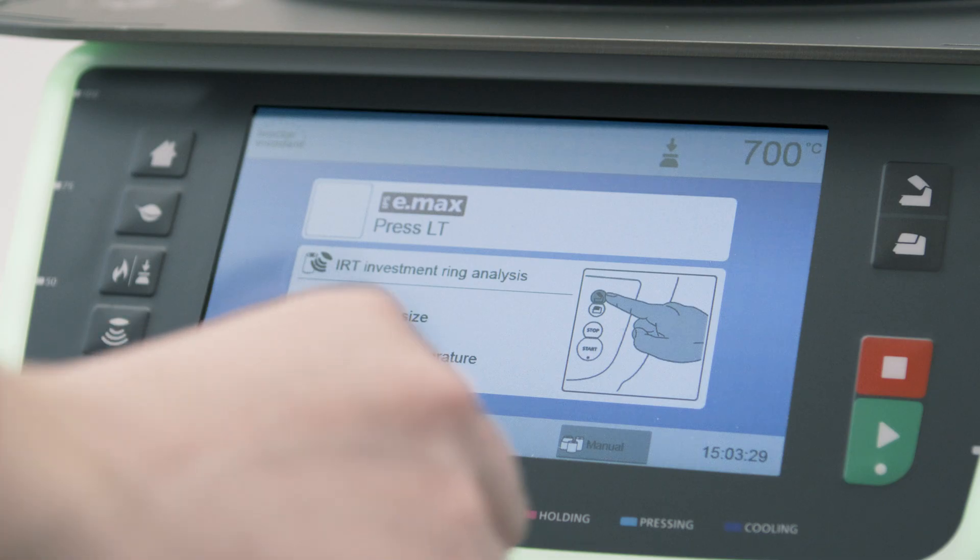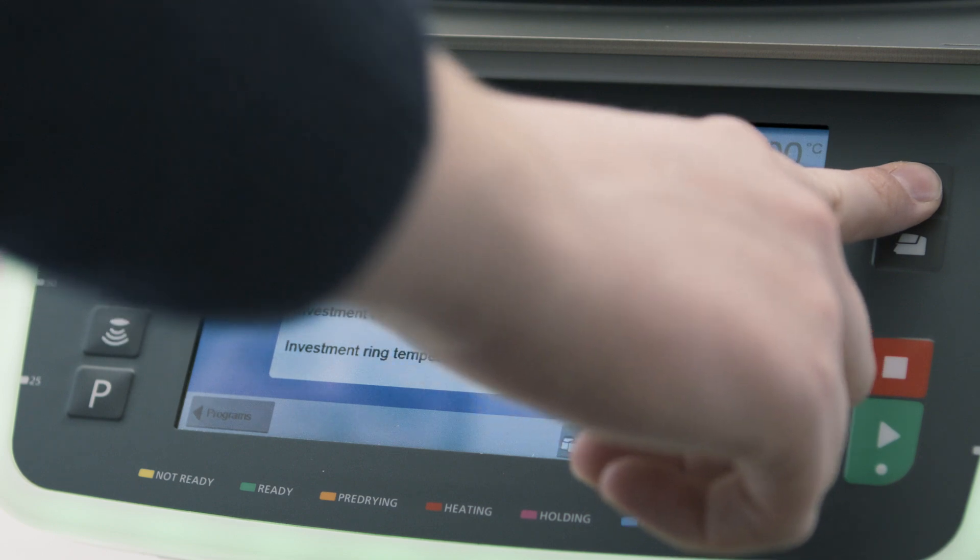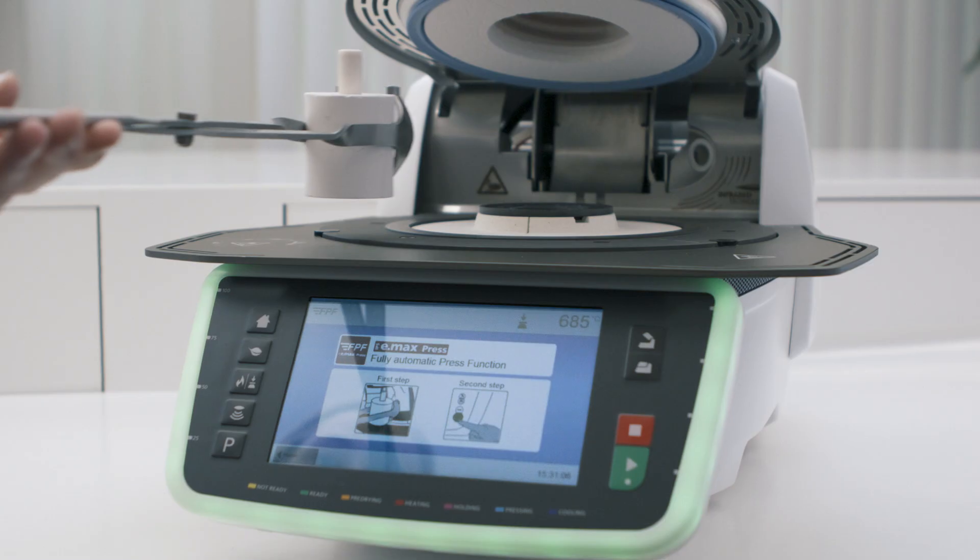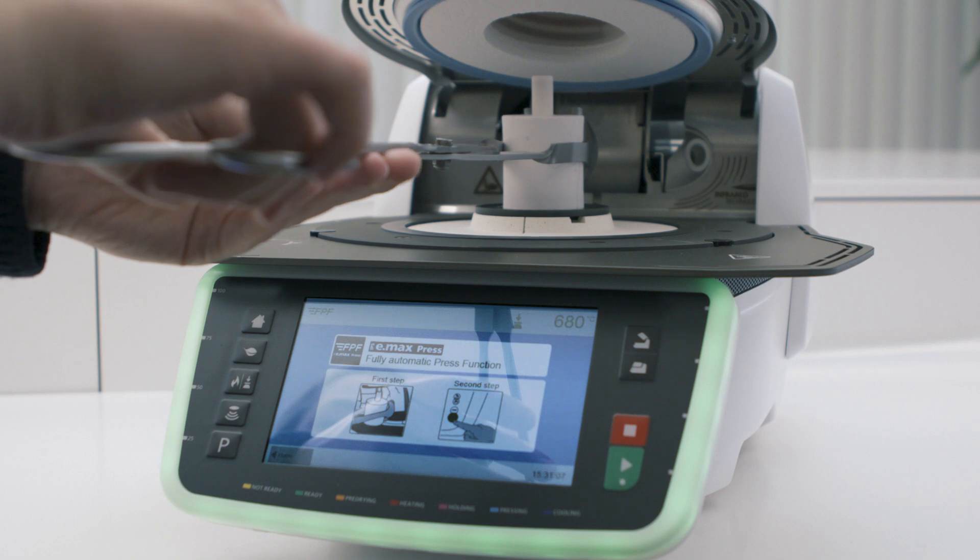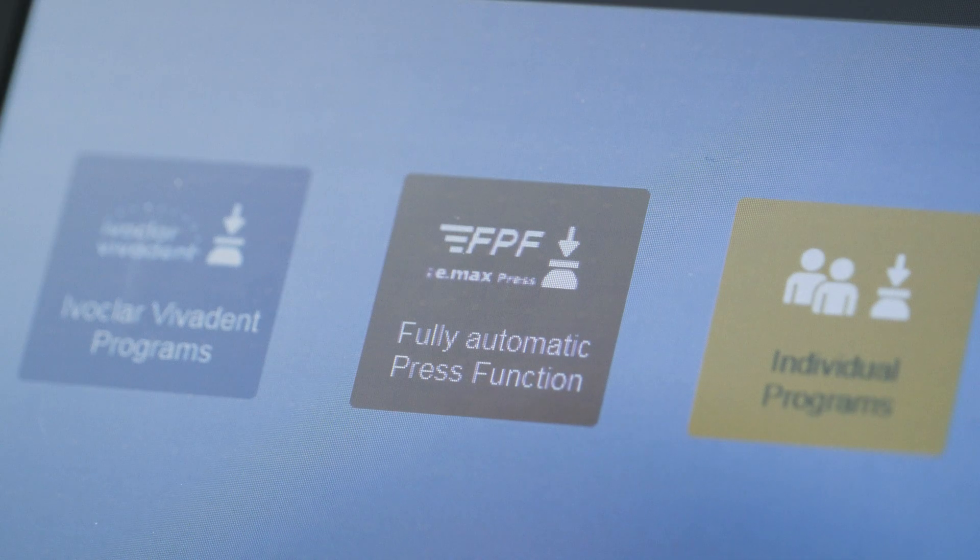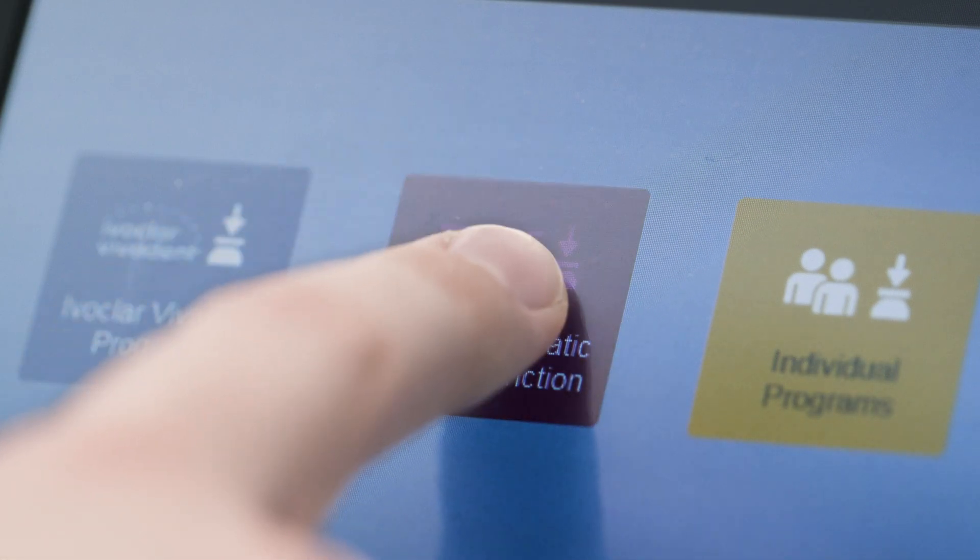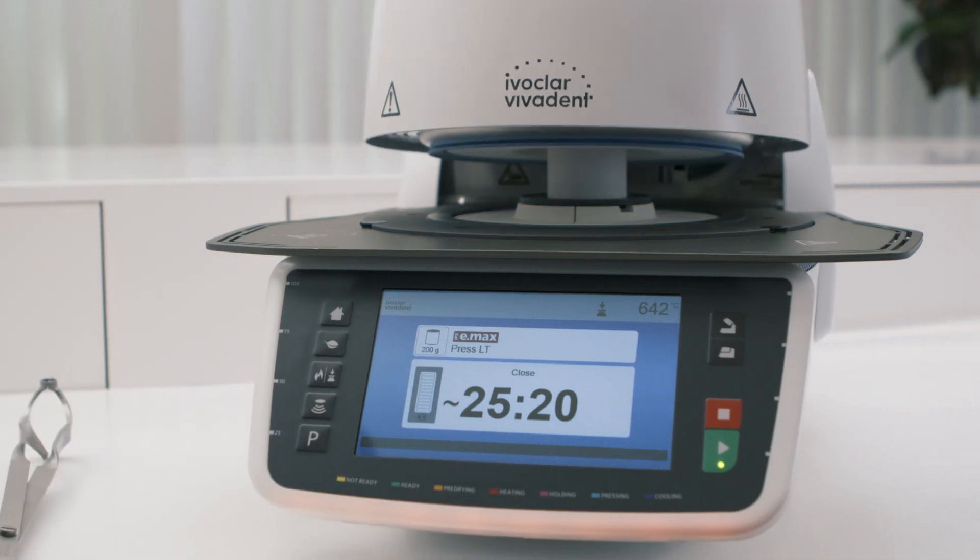To conduct a press procedure by means of the FPF Fully Automatic Press Function, open the furnace head and load the furnace with the correctly preheated investment ring. Press the FPF button on the display. Press the Start button to start the press process.